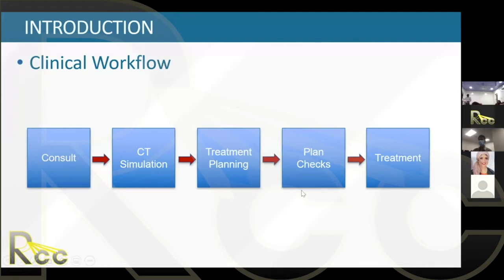Once these plans are completed, they are sent to our medical physics department, and then the physicists check all the plans to make sure that they're all correct, everything is accurate. Then they're signed off by the radiation oncologist, and then they are ready for treatment.